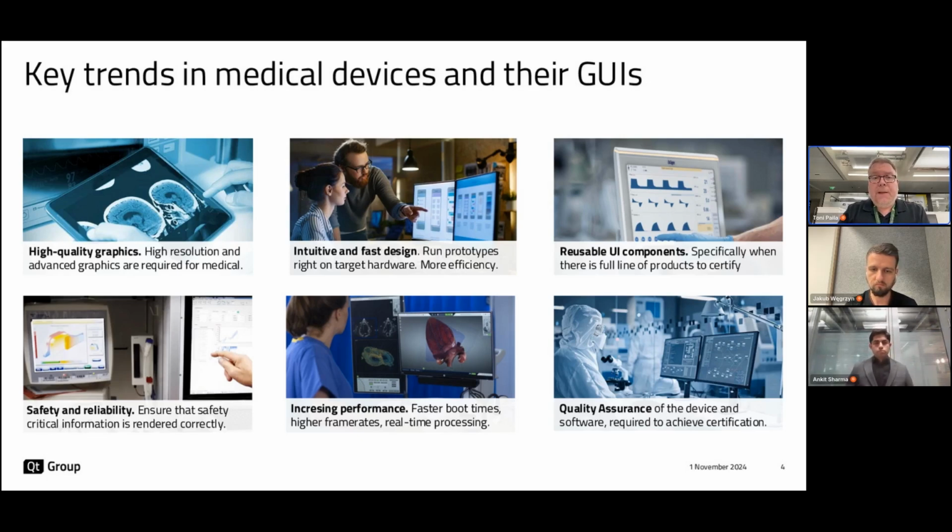Thanks to the advancement of display technology and panel technology, and also in microcontroller technology, higher and higher resolution graphics are available, and in many medical use cases, high resolution graphics are required to see exactly all the details in the picture.